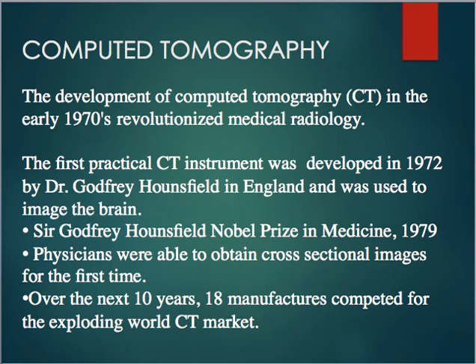So CT was a huge, major advancement in diagnostic imaging. This was the first time that doctors could obtain cross-sectional images, or slices, of anatomy. It really helped open up the world to diagnose a wider array of illnesses and injuries than were ever possible before. This was huge.